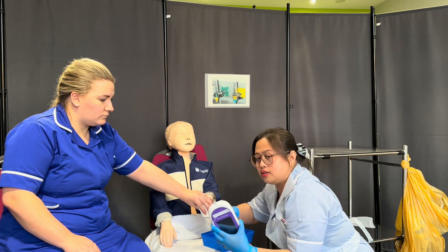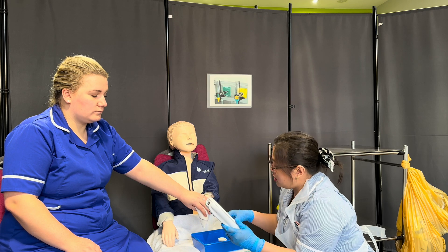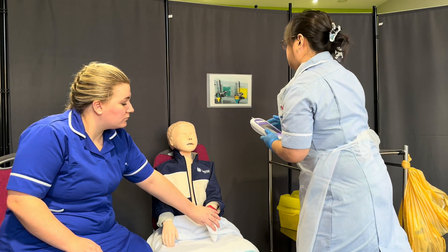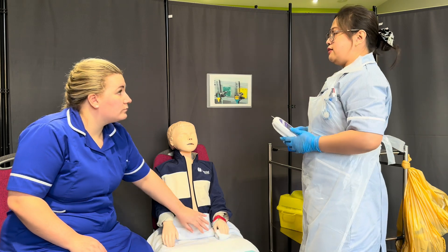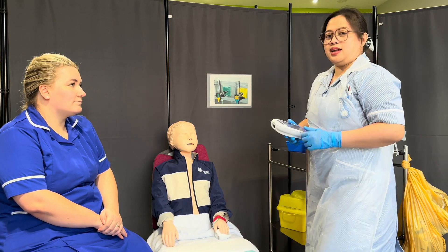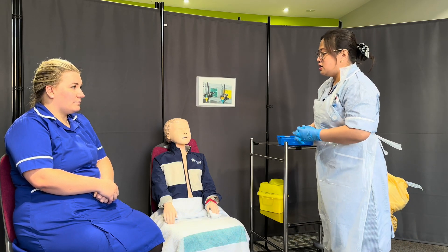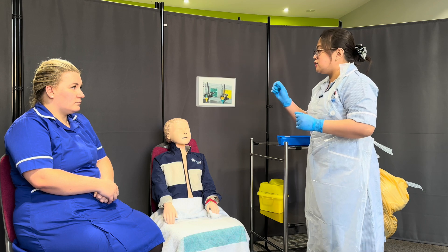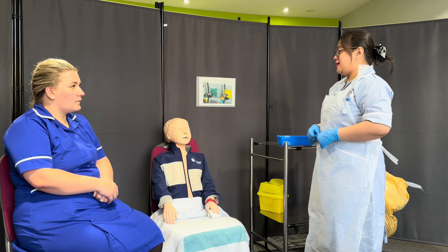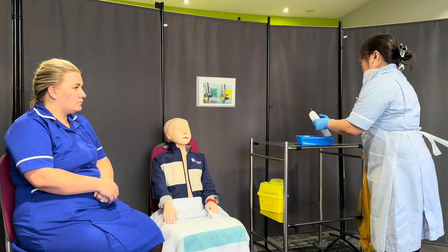The result, examiner? 6.9. Okay, that's good. So Mary, the result of your blood glucose is 6.9 — that's normal, so you don't have to worry about it. I'll let the doctor know the result right away. Do you have any questions for me? No, no questions. Okay, that's good. So if you need anything, the call bell is near you — you can press it and we will come right away. Thank you. I will now dispose of everything I've used.